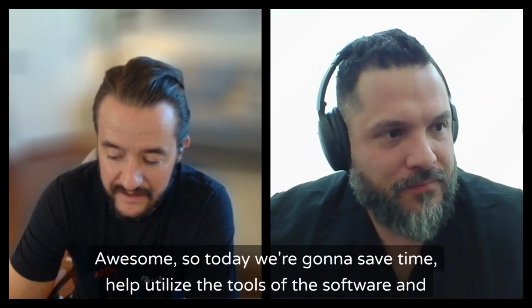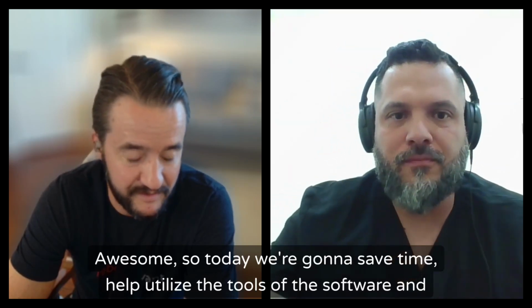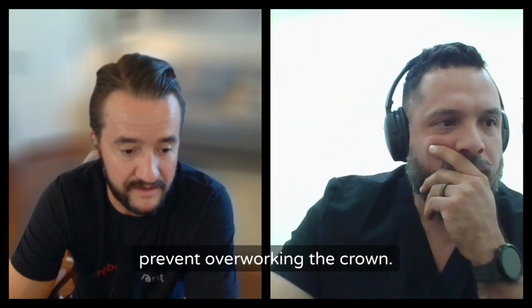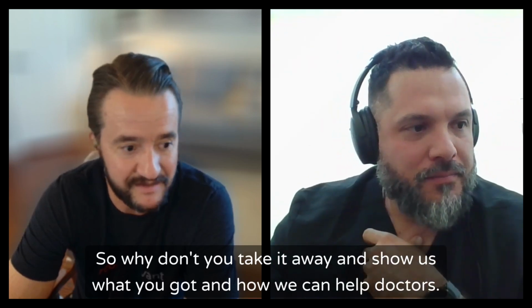Awesome. So today we're going to save time, help utilize the tools of the software, and prevent overworking the crown. So why don't you take it away and show us what you got and how we can help doctors?